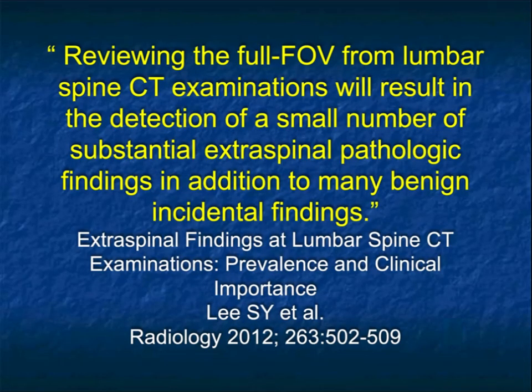Now, I remember when we had these arguments, I made the point that radiologists would never, ever decide only to do a limited field of view. But after I said that, I remembered, what about lumbar spine exams? We target the lumbar spine or the T-spine because we want to really look carefully at spatial detail in that area. But you're scanning the entire chest or the entire abdomen when you're doing those spine CTs. Why don't we look at the full field of view? Is your practice looking at the full field of view? Well, the answer probably is not, because the spines are read by the neuro people who can't read the abdomen, and so you don't reconstruct the abdomen.